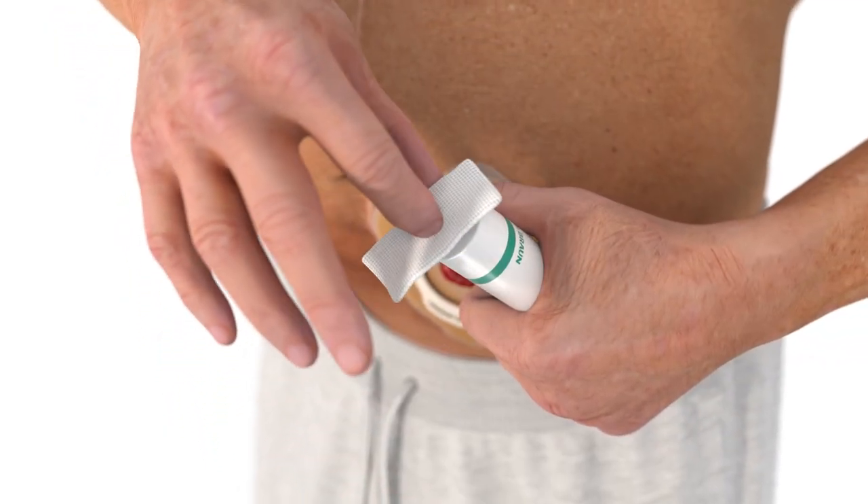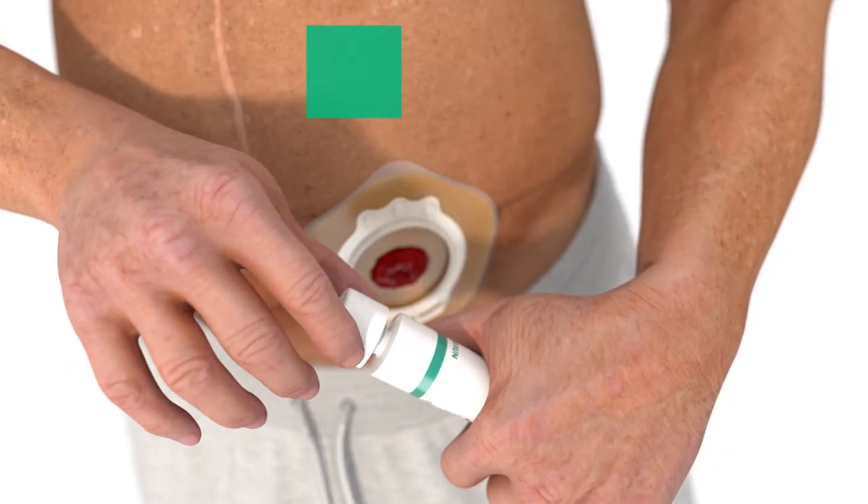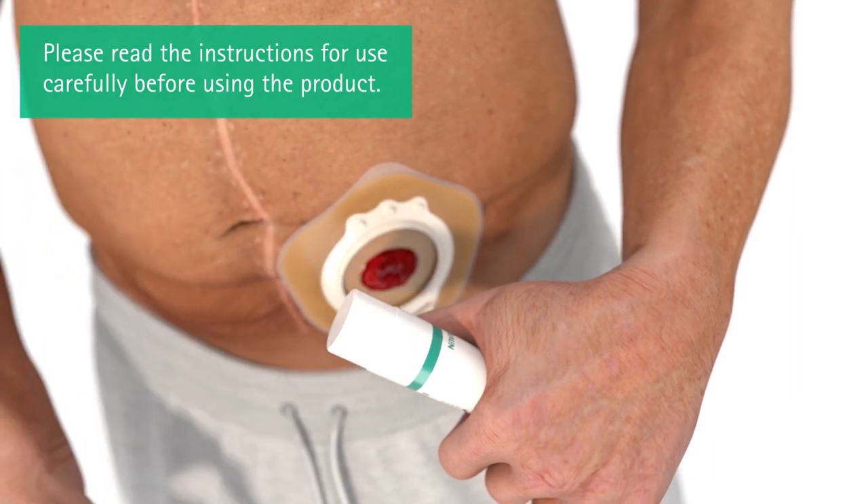Remove the residual paste on the tube with a clean tissue. Recap the tube tightly to prevent contact with moisture.